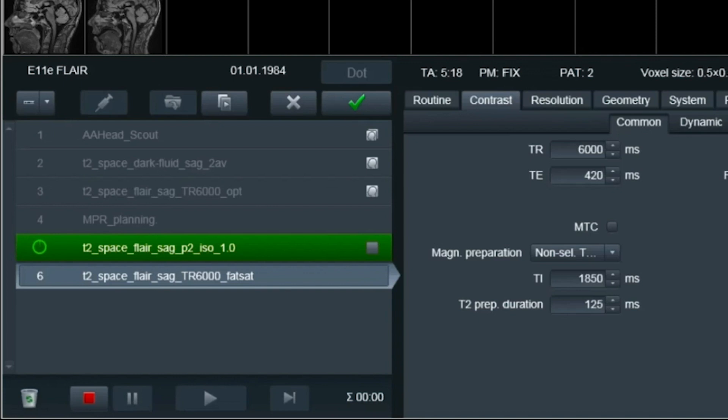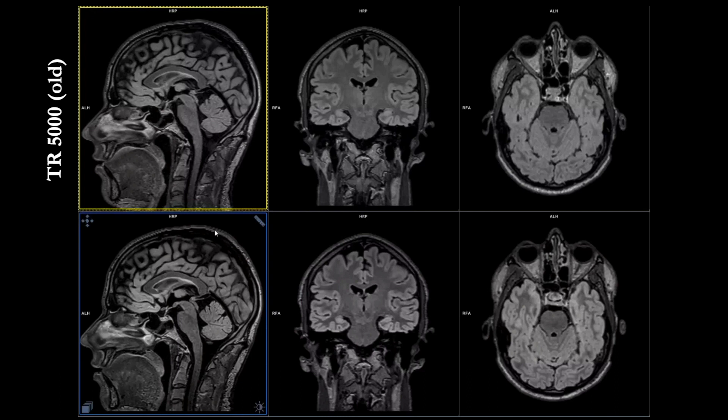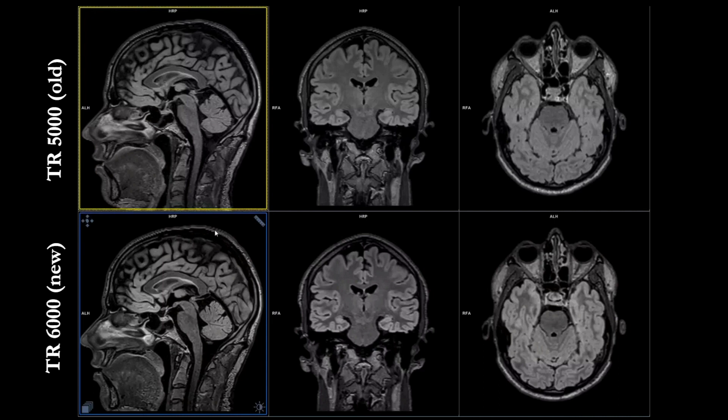We're going to go to viewing and we're going to compare. In front of you here you have the upper row, which is the old sequence with TR 5000 and using the old prep pulse like you used to do in the old software. The lower one is the new one which is optimized with TR 6000 and with the non-selective T2 prep pulse, the new pulse on E11E. So let's compare this one.